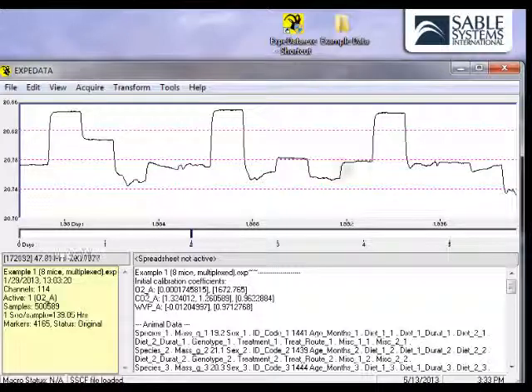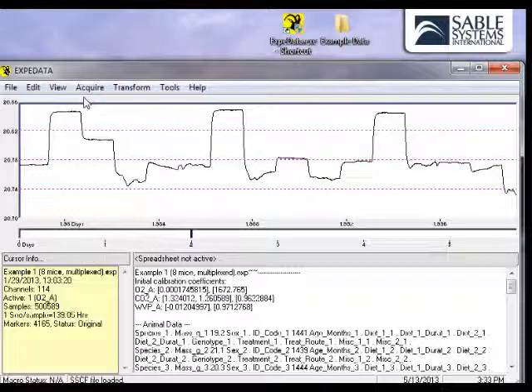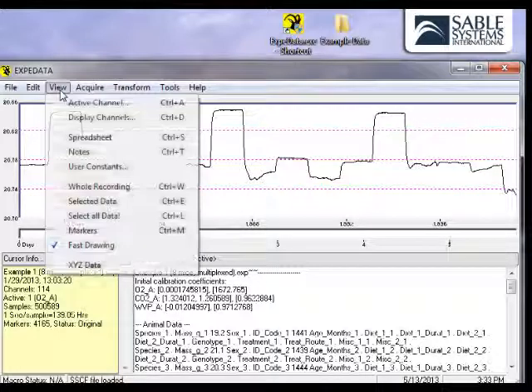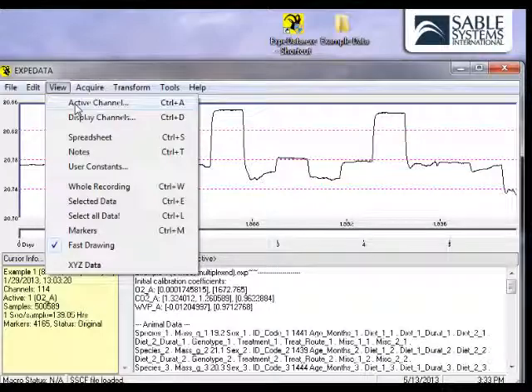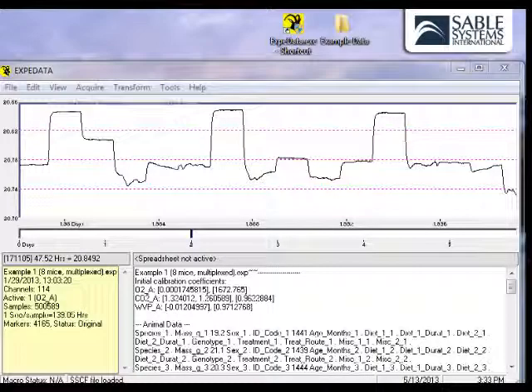Now, let's see how we can change the channel that is viewed. The channel that is visible in the graphic window is called the active channel. We can change that active channel by clicking on the View menu and choosing Active.